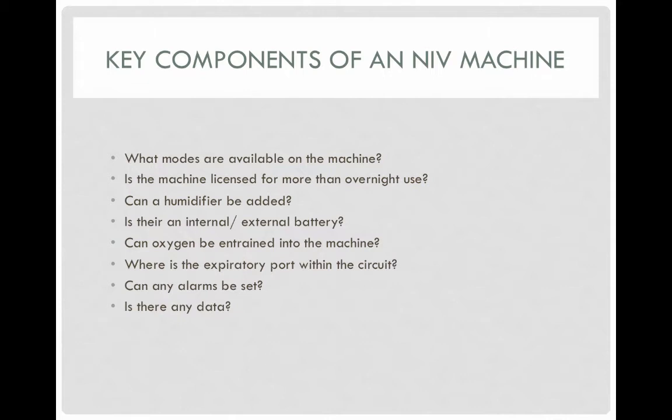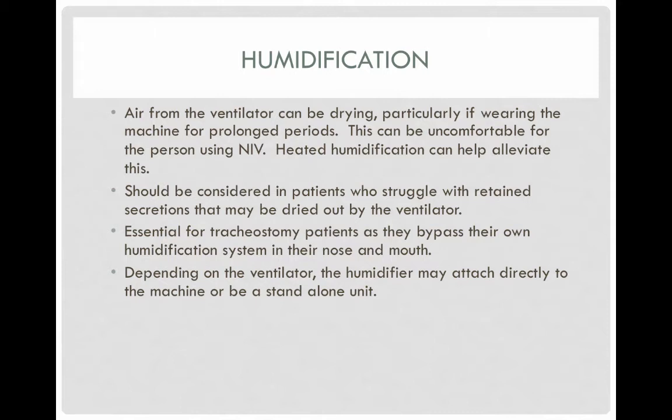Humidification can be helpful in the use with non-invasive ventilation. Our machines here at Boise State don't have humidifiers added, but you may see them added to some of the units that you're working with in the hospital. Primarily because if these are used over long periods of time, it is a lot of airflow. It can become uncomfortable if the airway is dried out more. Almost all home use CPAP machines come with incorporation of a humidification device.